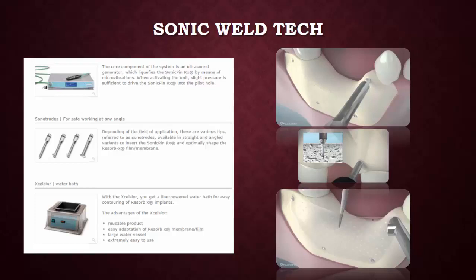So we use the core component of the system, which is an ultrasound generator, which liquefies the sonic pin by means of micro vibration. So it gives micro vibrations and it liquefies the pins. So the pins will be inserted into the pilot hole with a slight pressure and with the micro vibration, it's going to fuse with the internal side of the bone.